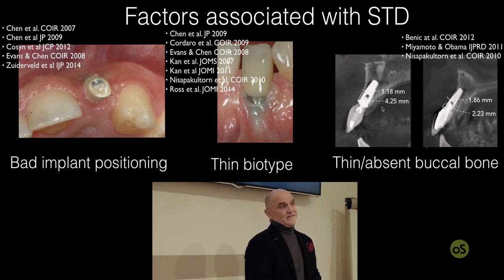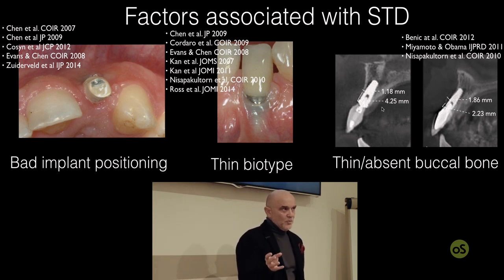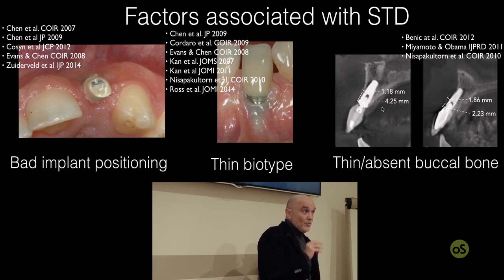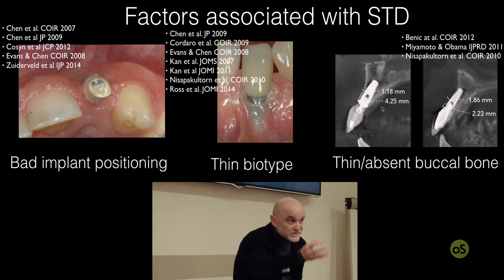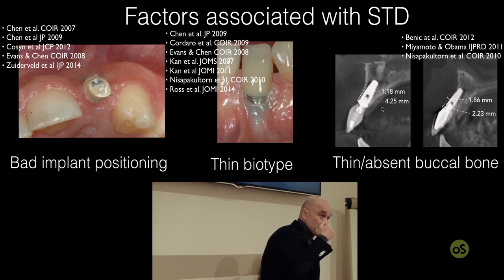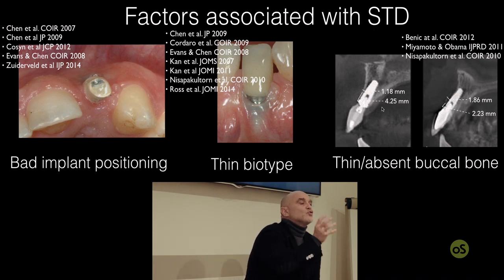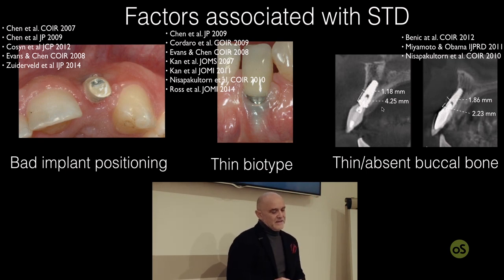And this is bad, because if there is gingival recession with no implant exposure, we can do soft tissue treatment only, while if there is gingival recession with also implant exposure, we also need to decontaminate the implant surface, which, being exposed, is contaminated by oral bacteria. And we know that decontamination of the implant surface is something we are not so good at, not so predictable, even if tomorrow we will see if there is something we can do.